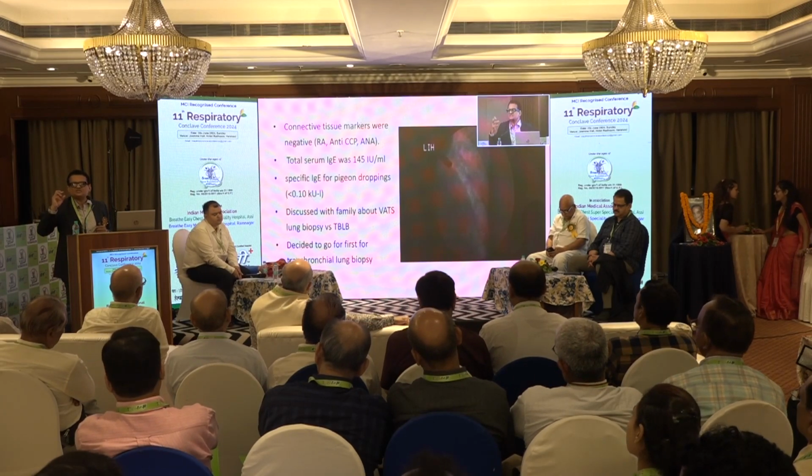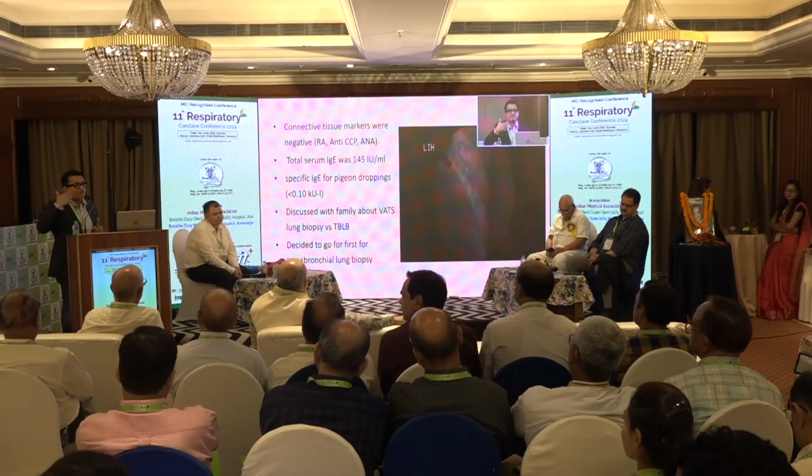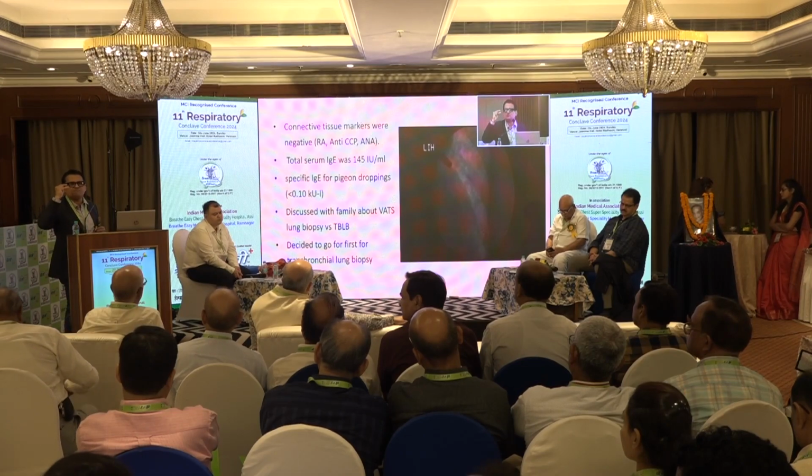ago. The discussion was, should we do a VATS? VATS was in fashion. That is video assisted thoracoscopic surgery, open biopsy. The other option was a transbronchial biopsy. VATS became important in practice because you could get bigger tissue and make a better diagnosis.